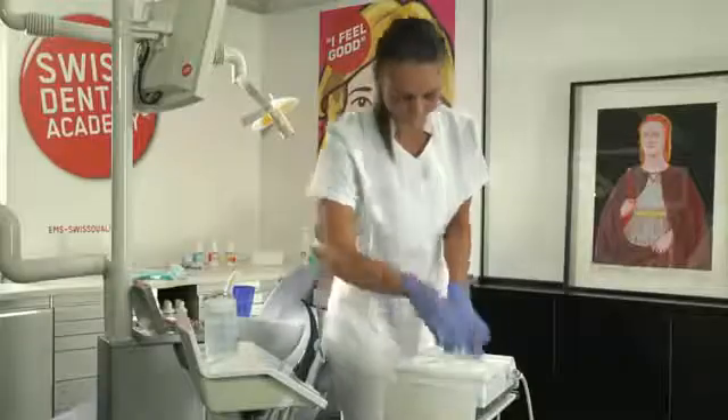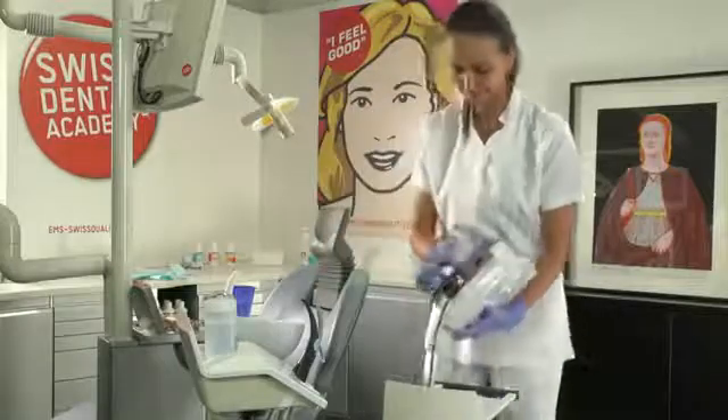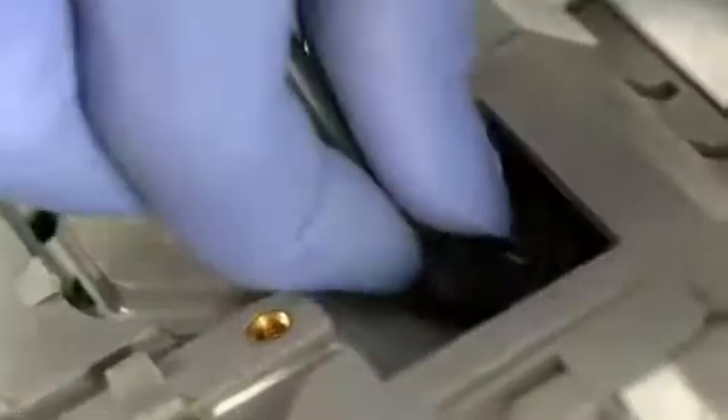On switching the unit off, disconnect the power supply, then the water and air inlets, as well as the foot pedal connector. Take care not to pull the connector safety tab.